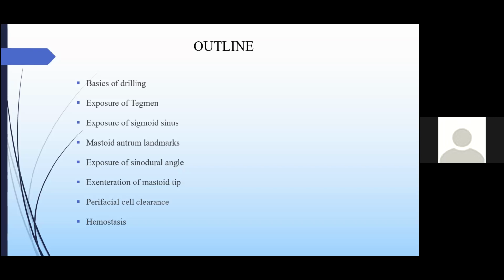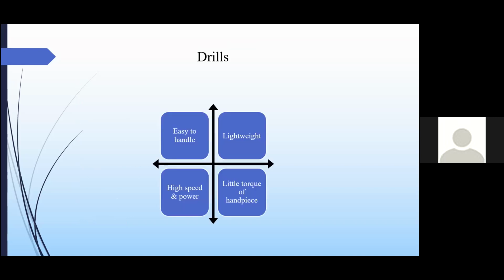So we can realize how dangerous yet wonderful an instrument we have for our temporal bone surgeries, and it can easily result in serious complications. So one must undergo intensive, mandatory training in the temporal bone dissection laboratory to gain the ability to use this accurately and avoid any complications. So let's start with the tools of mastoid drilling.